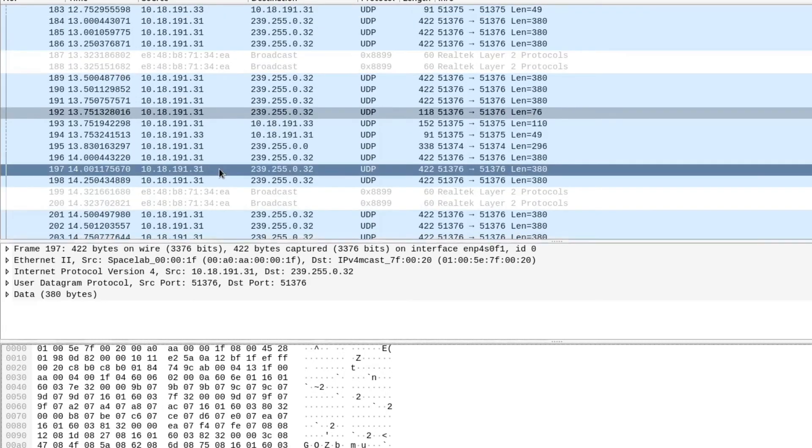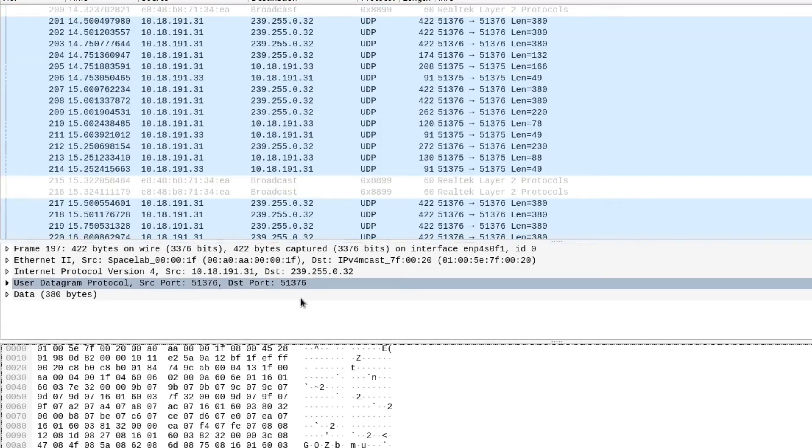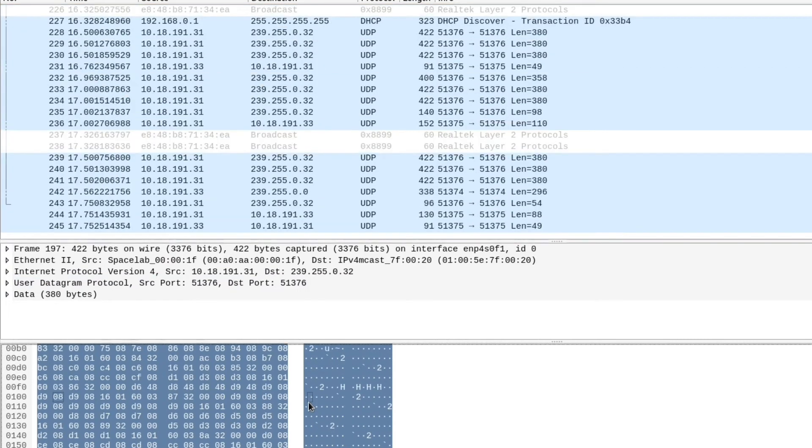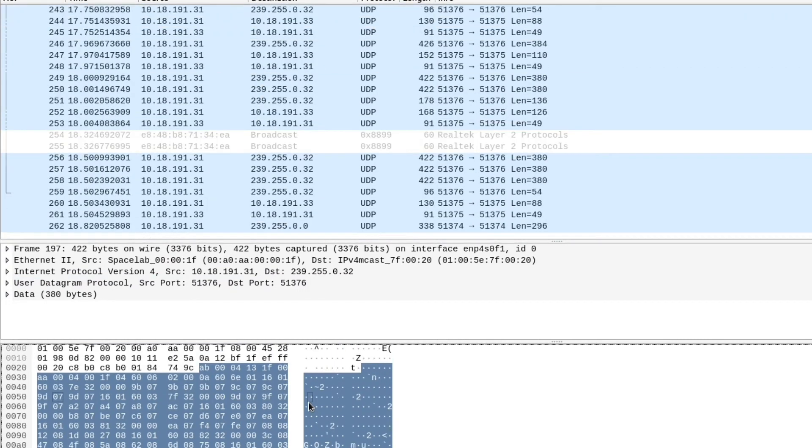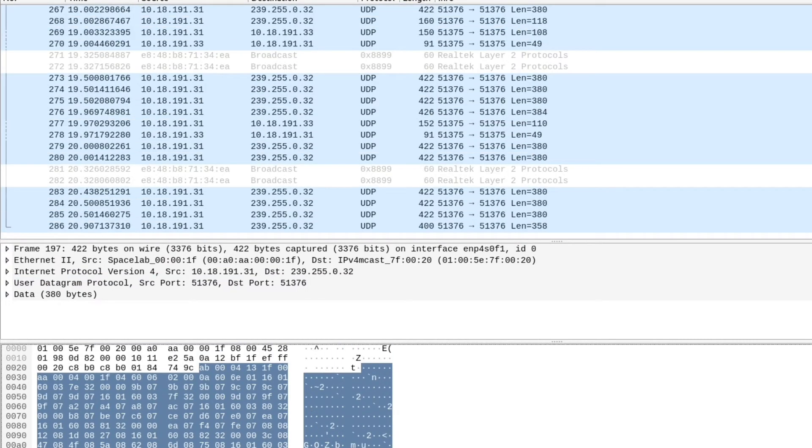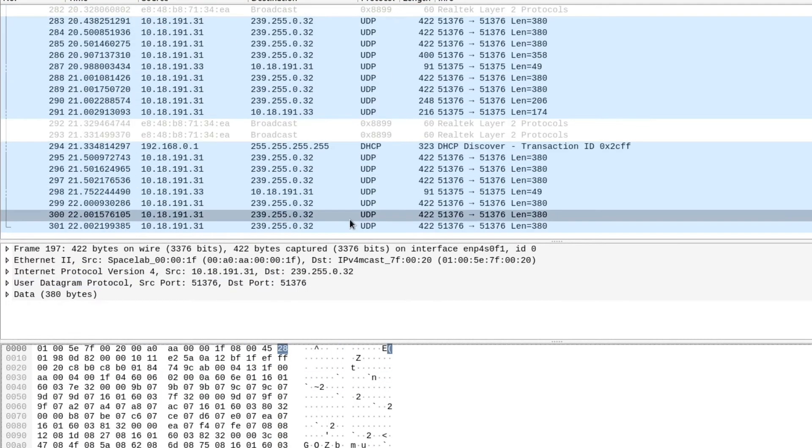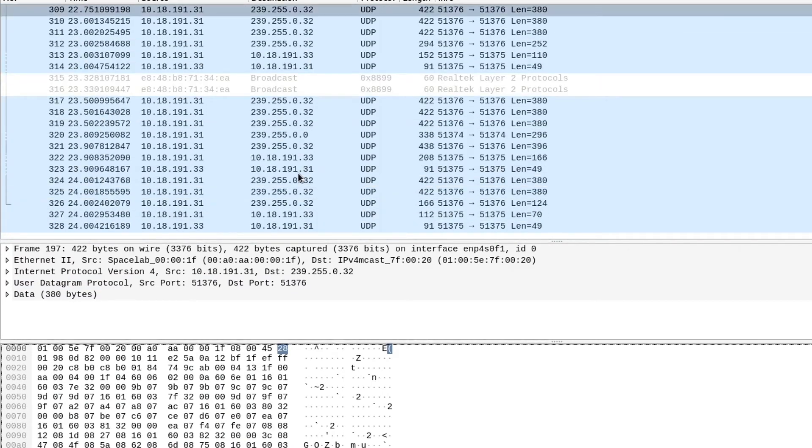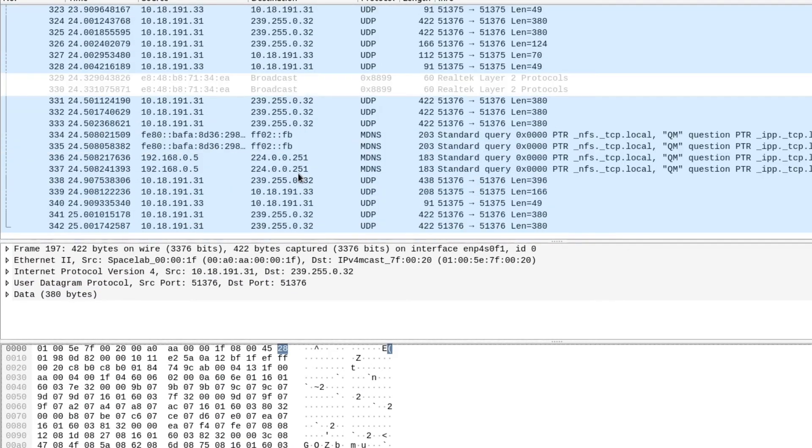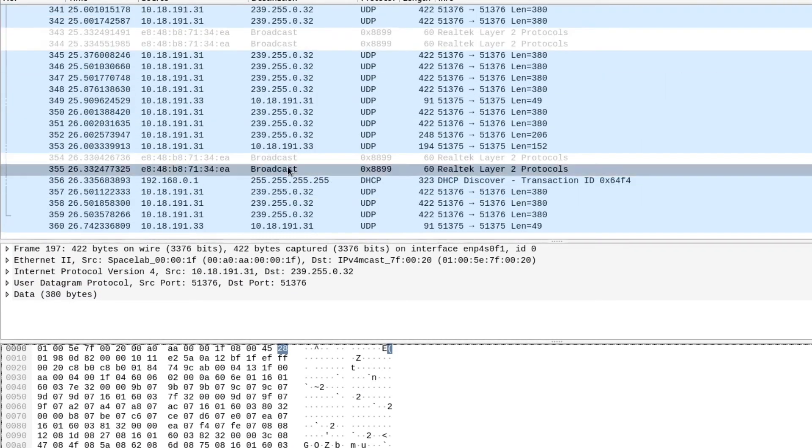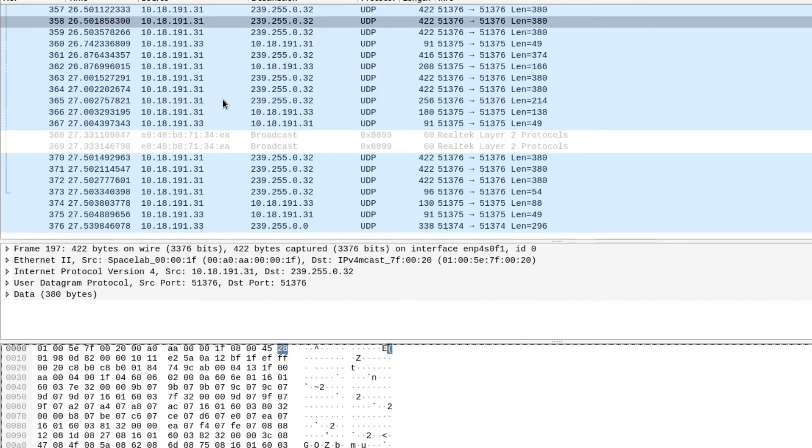Unfortunately, the traffic is not viewable. It's all encoded. It's proprietary. So we can't really see what these values mean, but we can see that there is traffic going between 31 and 33 at a pretty continual rate.